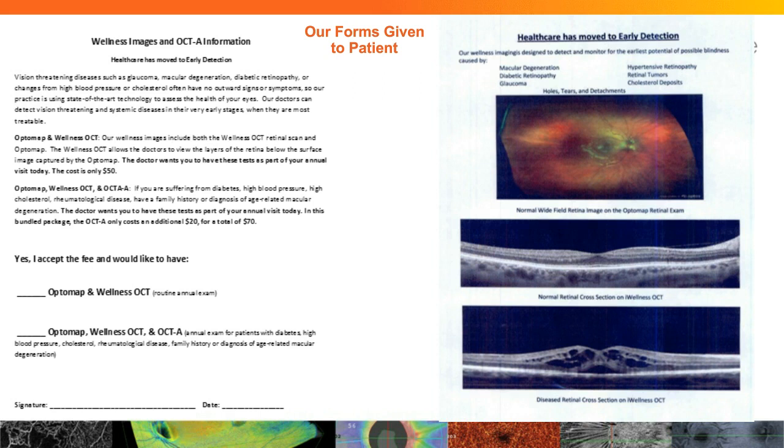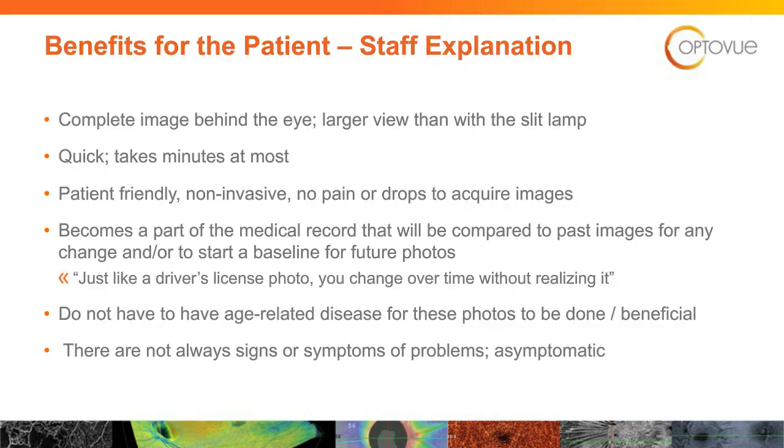So, it benefits the patient to have the staff explain. It's a complete image behind the eye. It's a larger view than the slit lamp. It's quick. It takes minutes at most to acquire it. It's patient friendly. Again, non-invasive, no pain or drops required for these images. It becomes part of your medical record that will be compared to past images in looking for changes.